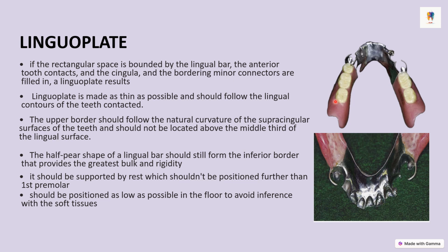If you're getting my point here: you place a lingual bar and then cover it with metal up to the cingula of the teeth. That makes your lingual plate.